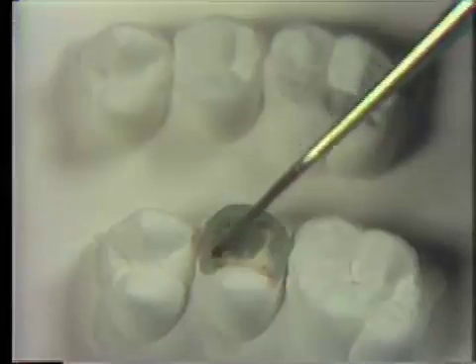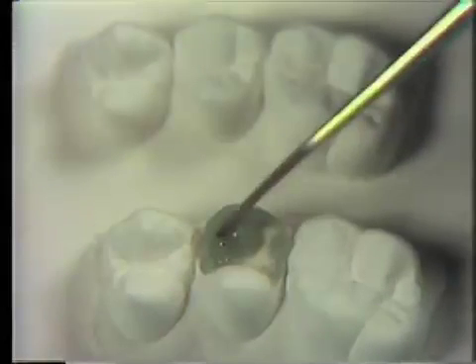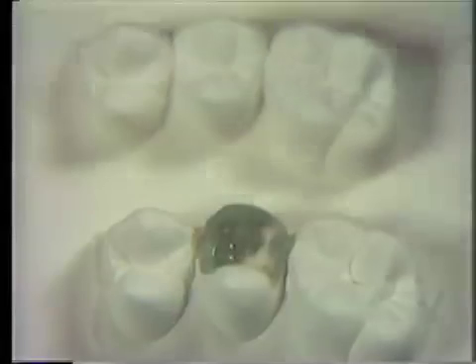Additional wax is added to fill in the missing parts of the occlusal morphology. As wax is continually being added, try to visualize the amount necessary for its anatomy so that excess wax does not have to be trimmed later. Also note the position of the central fissures to the adjacent teeth.